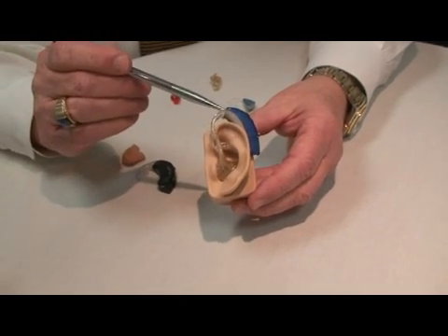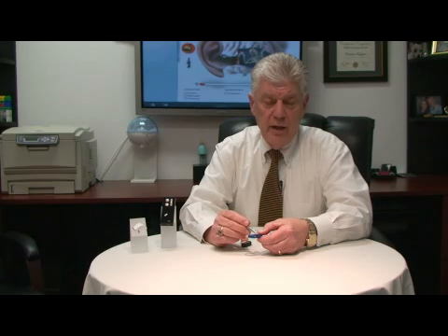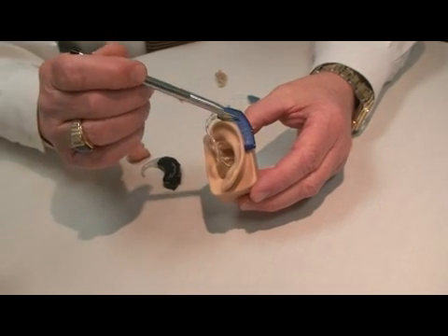The sound is delivered into the ear through the ear mold. The sound is entered through the microphone and then processed by either an analog or a digital processor inside the hearing aid.